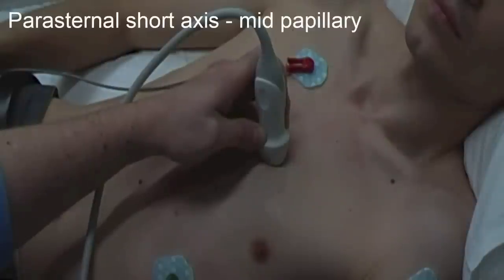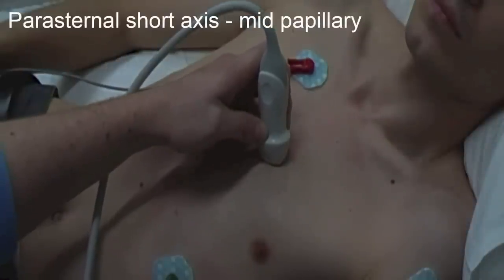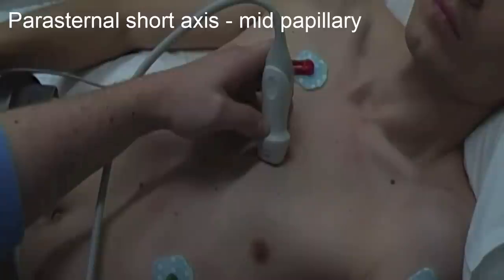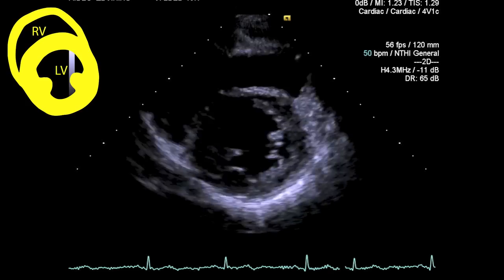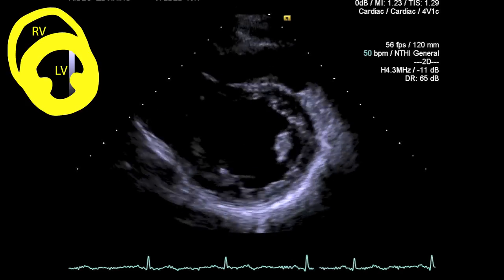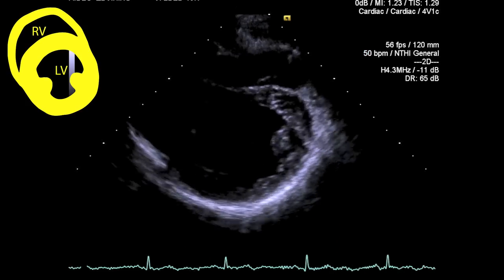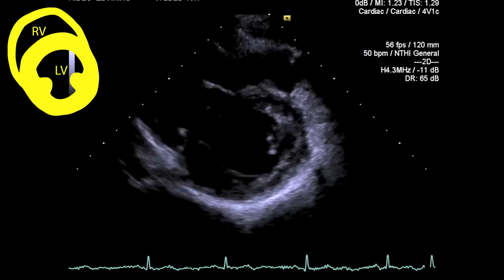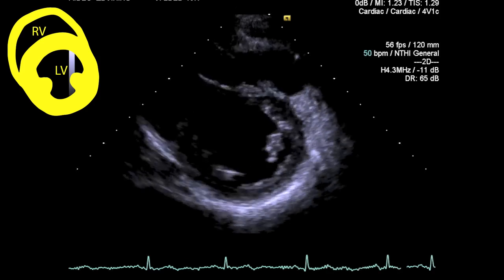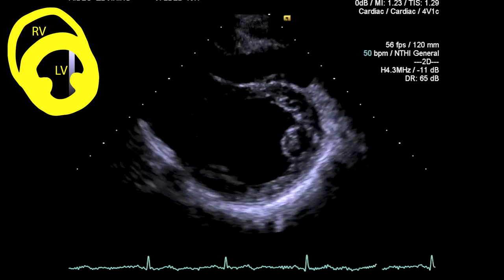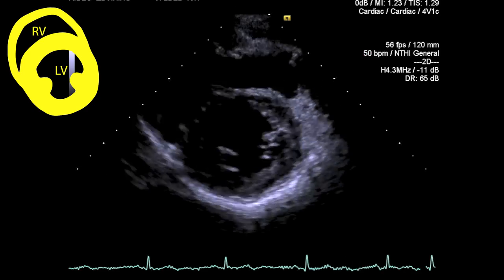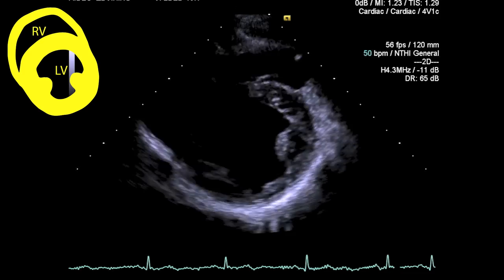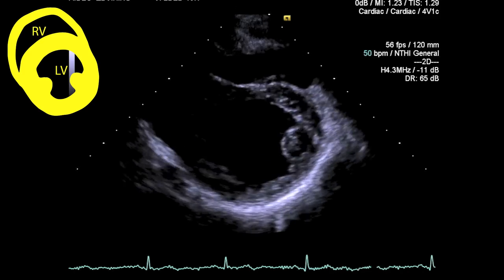The parasternal short axis midpapillary view is achieved by tilting the probe even more inferiorly down towards the mid cavity of the left ventricle. Make an assessment of left ventricular wall thickness and contractility, and look for any gross regional wall motion abnormality. Also have a look at the pericardium lying around the heart to see if there's any obvious pericardial effusion.